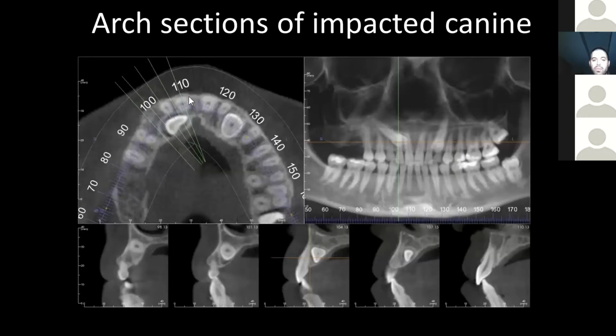So just by paying attention to a few details on the screen, it's fairly intuitive to figure out what exactly you're looking at. And then it gets even more intuitive when you can grab this with your mouse or with your scroll wheel, start moving things around, and these all update. It's very dynamic, it's fun, and I love it.